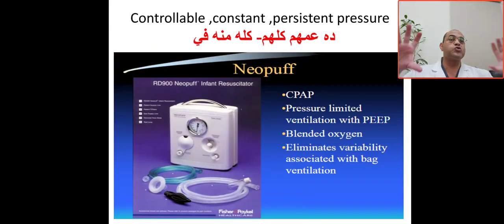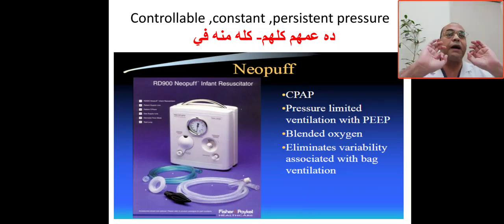Here is the most important part. This is the magic: the NeoPuff, or call it the T-piece resuscitator. All in one. We'll take the benefits first of all. CPAP. So the NeoPuff will give you CPAP.